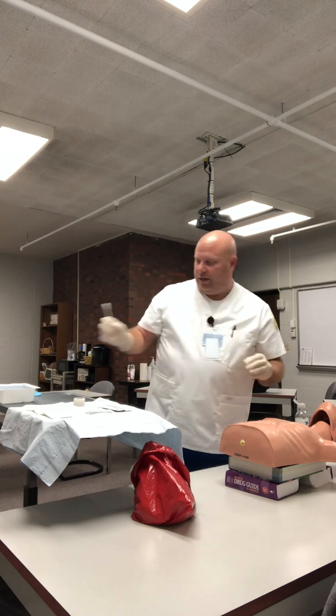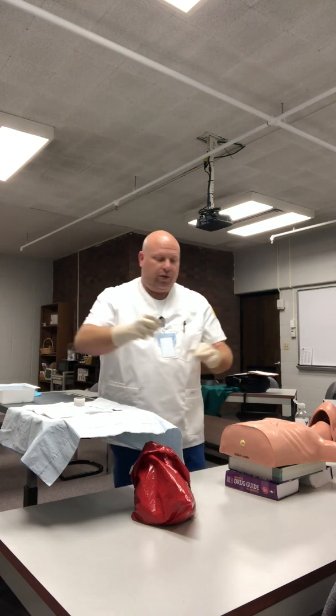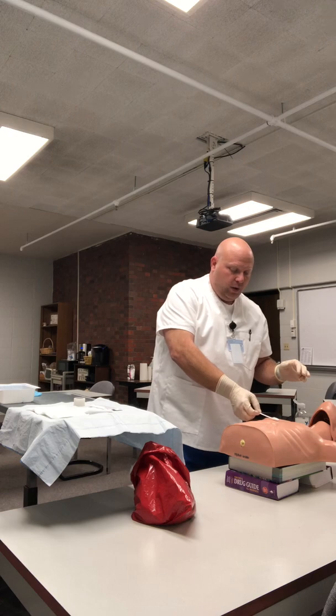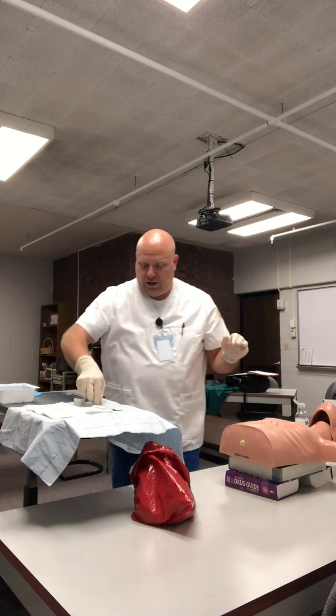One way only. I'm going to discard. I'm going to grab another one, and I'm going to clean the outside of the wound closest to me. One motion, one direction, one time only, rotating as I go down. I'm going to bring that around. I'm going to drop that in the trash.